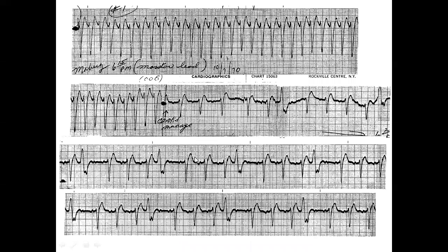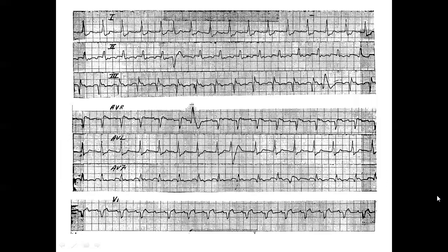Then with the carotid sinus massage, you can make it 2-to-1. Then what do you see? Atrial, atrial, atrial, atrial. So that's V1, but in the inferior leads, during the long pause, you typically see a good flutter wave. Of course, you have to be able to recognize this as a flutter wave. If you don't, you will never make atrial flutter. So this is a good atrial flutter.